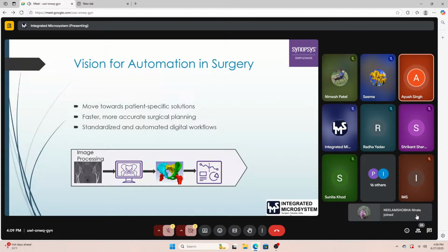If our data has too many noises, we are supported with various noise removal tools. We can use a Gaussian filter or a mean filter to reduce the noise. But sometimes these filters might also cause distortion in our images. Distortion in the sense that if it removes any small element, any other small feature that is present might also get removed. So we need a proper overview of the image data set that we are working on, to have a very clear perspective of the same.